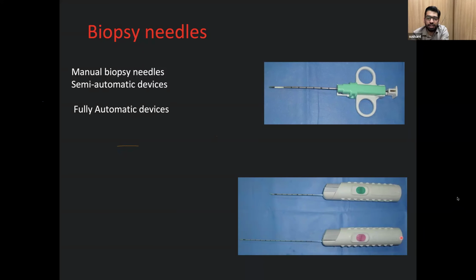I have shown you an end cutting biopsy gun. There is no side plate in this kind of biopsy gun, and we still do not have control over it. We just place it across the lesion, and under ultrasound guidance, when we fire it, it just goes beyond it. So there is no control over how we can advance. Again, this is automatic, but it is completely hollow. It does not have a side plate, so it will have a complete cylindrical core.